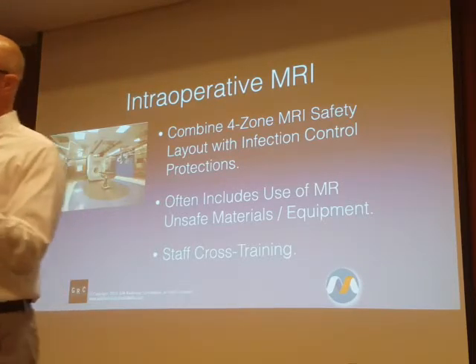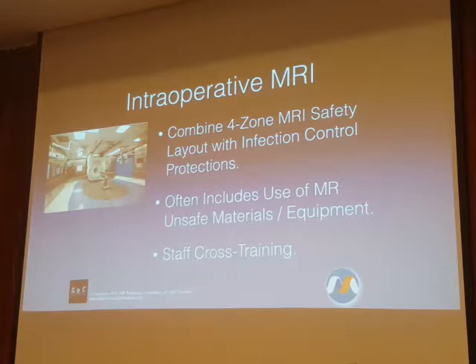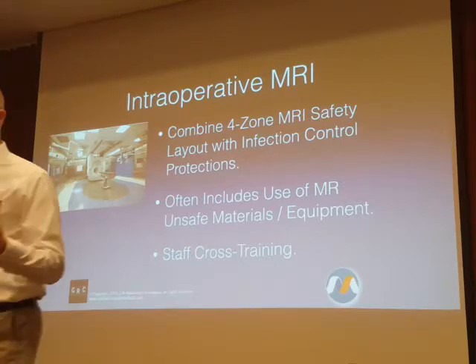But again, it doesn't necessarily play well with the 4-zone principles and access restrictions, access controls for 4-zone. It can be done well, it's just that out of the box, the default solutions from the equipment vendors aren't going to get you there.